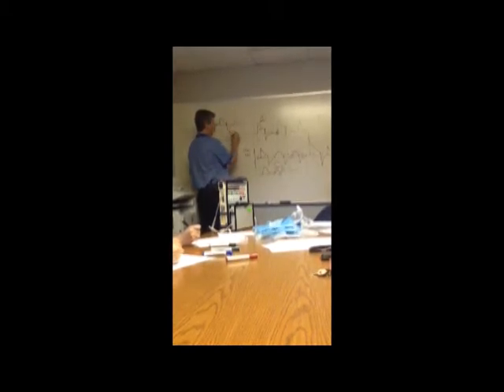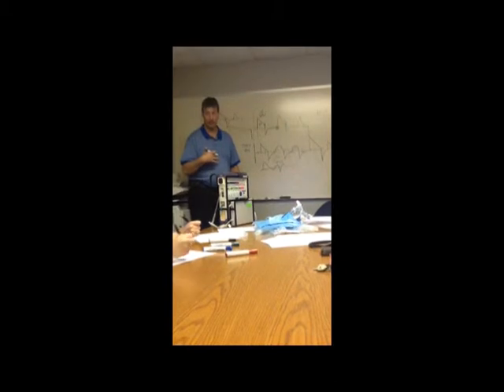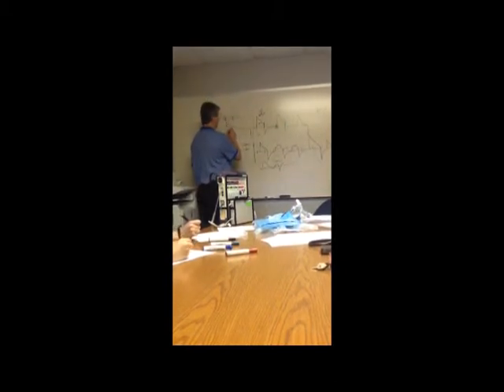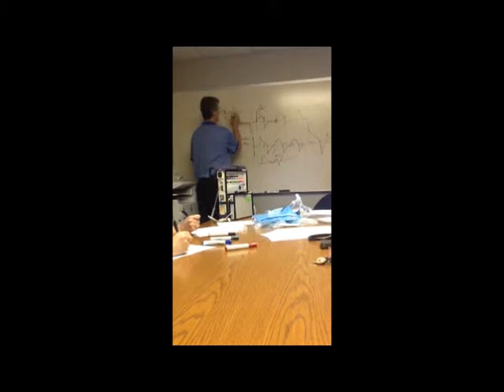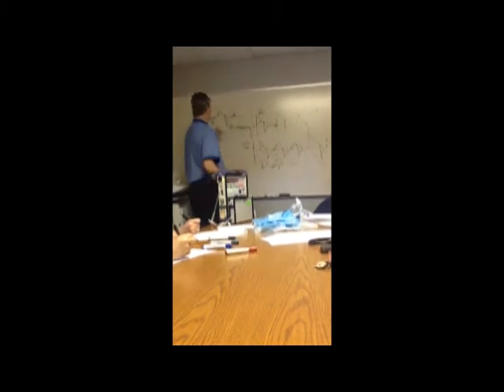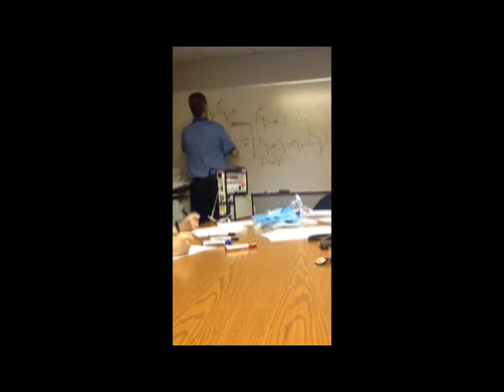And what I mean by when the breath stops, on pressure support, as long as you're sucking in, this will keep going. You suck in 2 seconds, it'll go 2 seconds. Once you stop sucking in, that extra little pressure support that you dialed in quickly reaches that number, and that's what ends the breath. It's ended because you quit sucking in. All right? So a pressure-supported breath can have a big volume, a lot under the curve, or it can have a little bit, and that depends on how hard the patient's sucking in. So that's the last mode, CPAP.